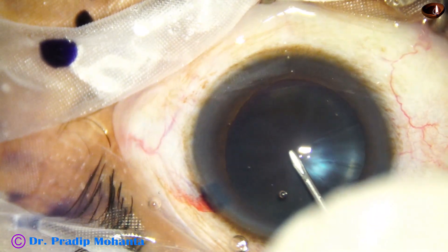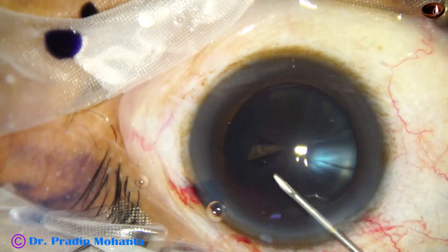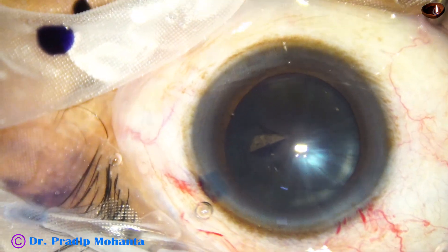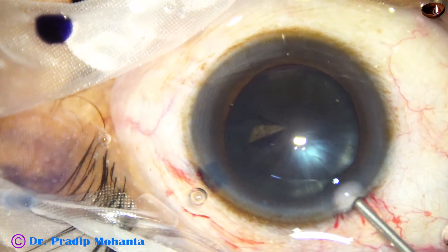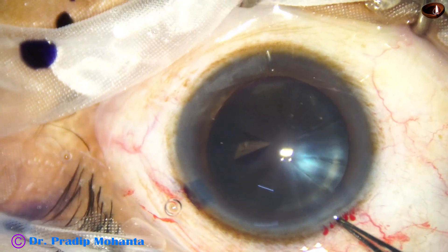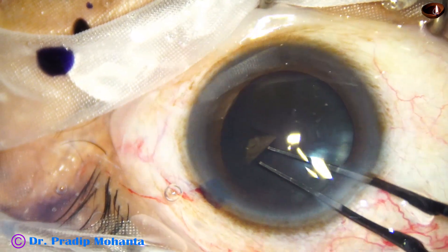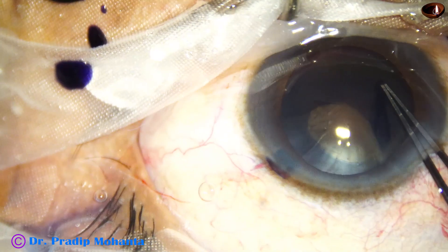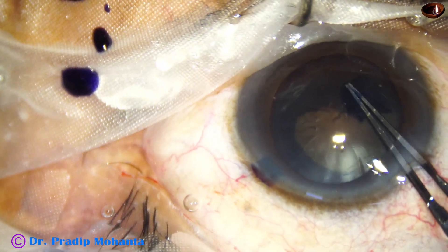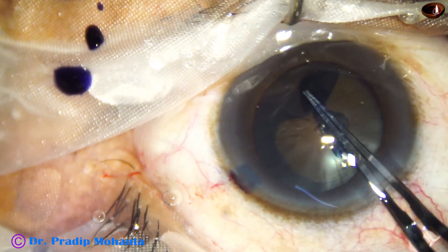First I take a cystitome to incise the capsule and raise a capsular tag, and now I take the utrata forceps. I add some more viscoelastic, then take the utrata forceps, hold this capsular tag, go anti-clockwise, and I am going to do a large rhexis — going along the border of the pupil to get an adequate size rhexis of about 5.75 millimeters.